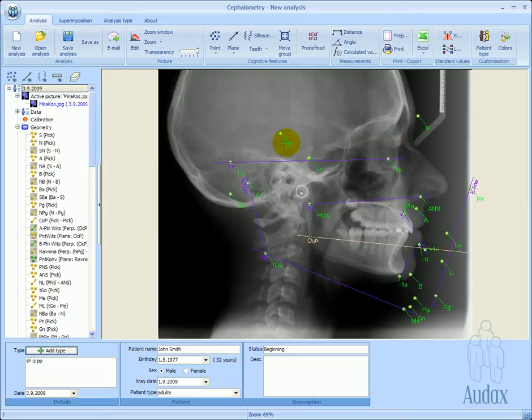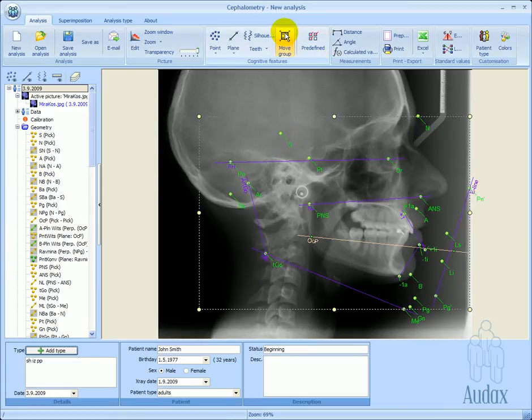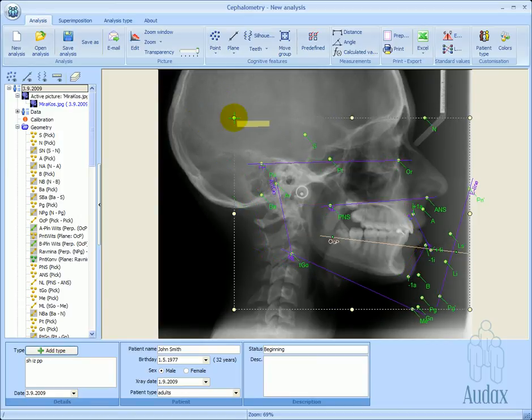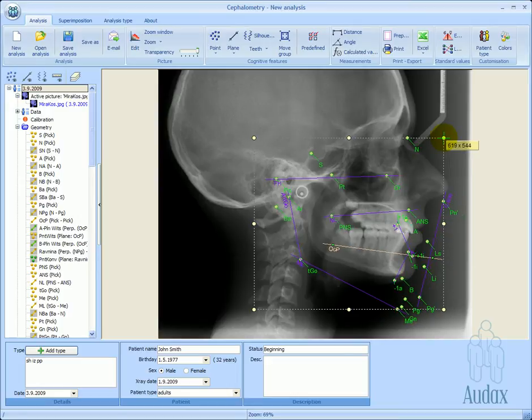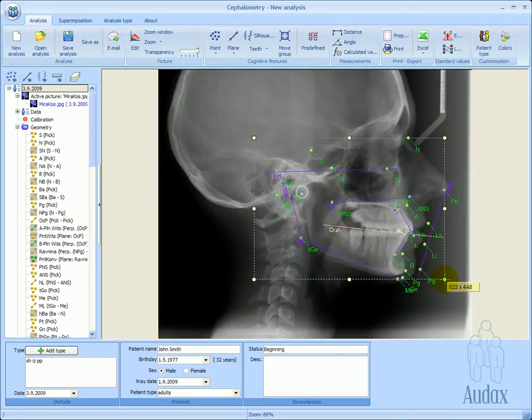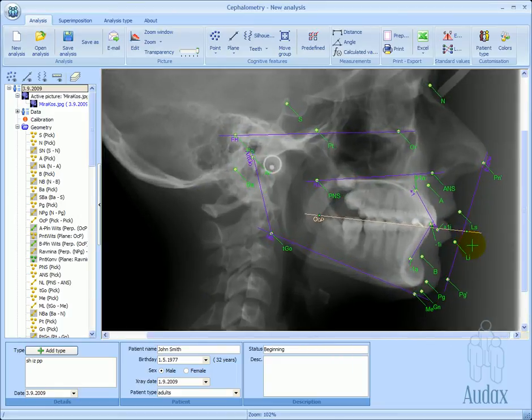On the screen, we can now see several points and planes that need to be positioned to the correct spots or landmarks on the soft and hard tissues for the measurements to be correct. We can also use the group move tool to position all points and planes in a single step, at the approximate location around the actual targets.